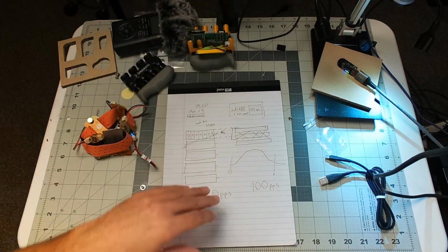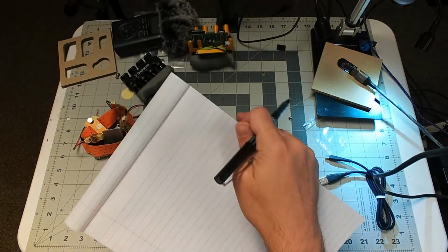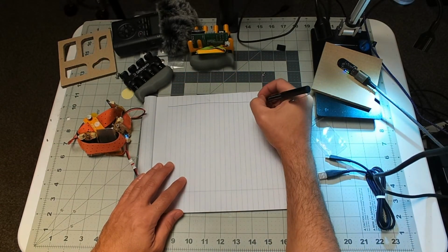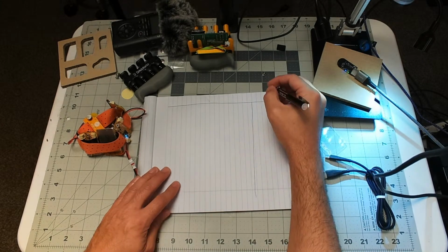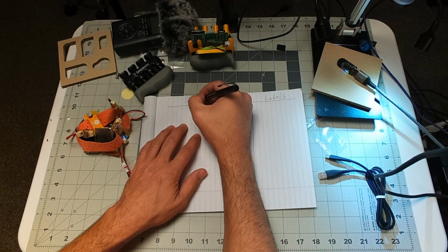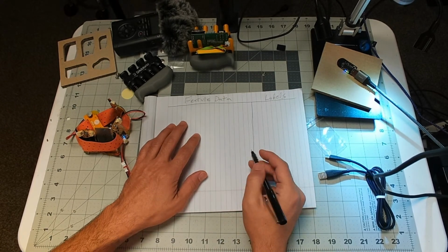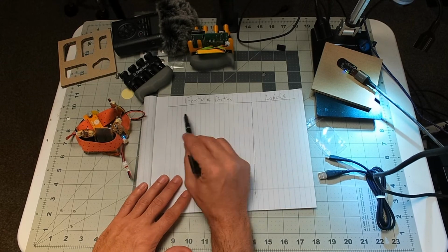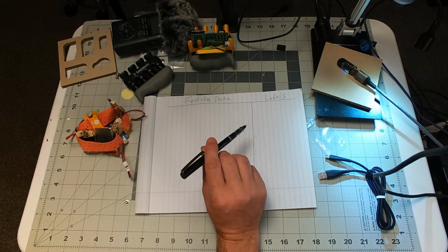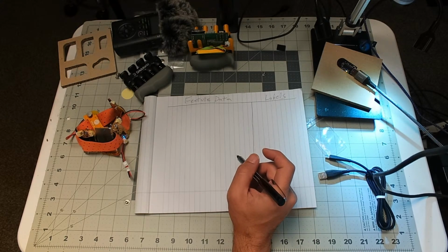Because ultimately, what we want to submit to the AI is a CSV file. And a CSV file is just a table. So this is going to be our labels, and this is going to be our feature data. My thinking is that I don't care. What's kind of funny is machine learning is kind of a cop out, because you can just give it all the information and say, "Hey, figure it out," right?